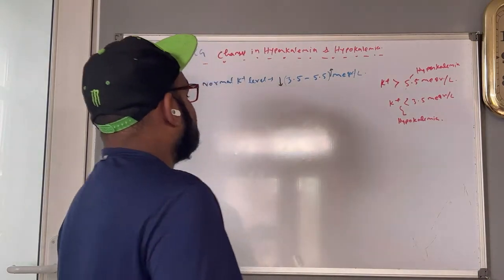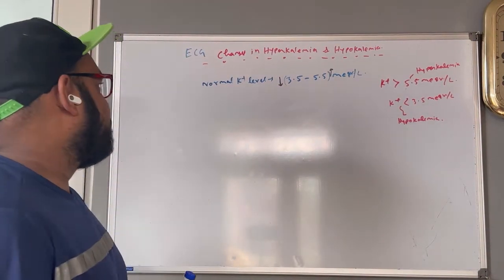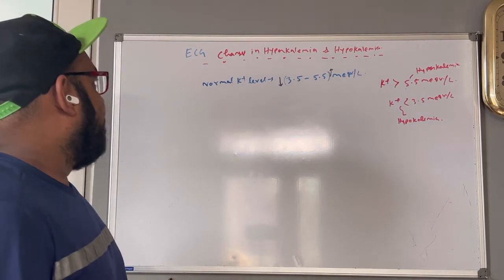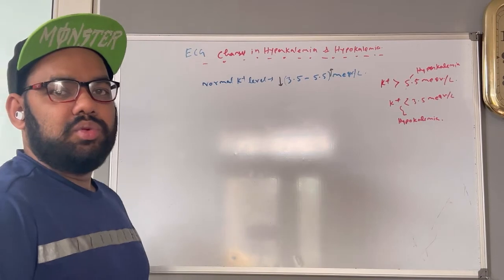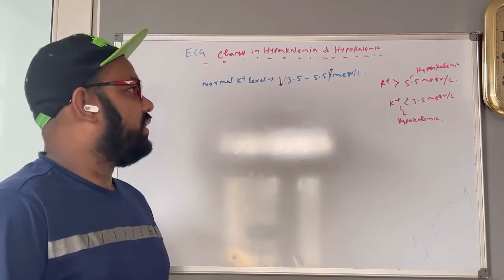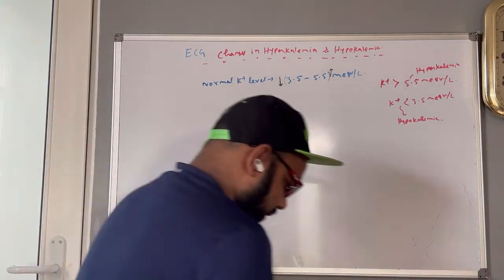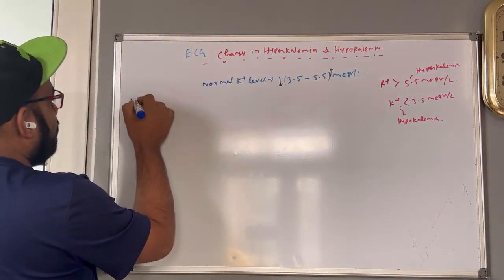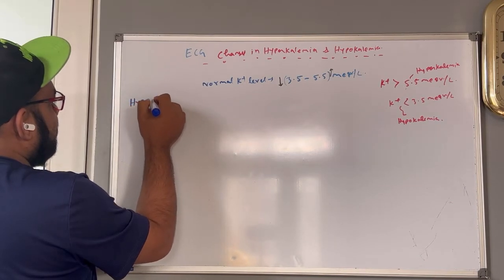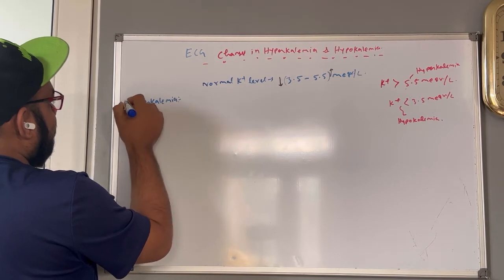Now I am talking in detail about the ECG, whatever changes we will get within the ECG. As far as the ECG is concerned, at first I will talk about hyperkalemia. So whatever changes we will get within the ECG whenever we see hyperkalemia, let's write it over here, guys. Hyperkalemia.